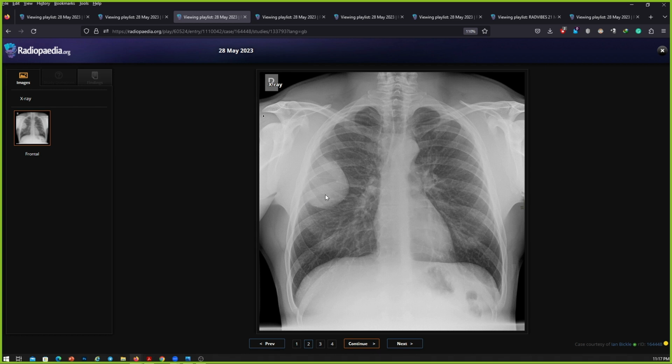So think of the other findings. You can think of cystic lesions, lipoma. You can think of bronchogenic cysts. No, bronchogenic cysts will be in the lung. So you can think of pleural lipomas. You can think of loculated pleural effusions. I think you said that.